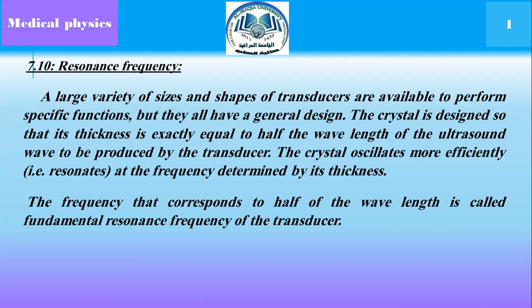A large variety of sizes and shapes of transducers are available to perform specific functions, but they all have a general design. هناك العديد من المحولات بأحجام وأشكال مختلفة، ولكن كلها تحتوي أو صممت بديزاين واحد.